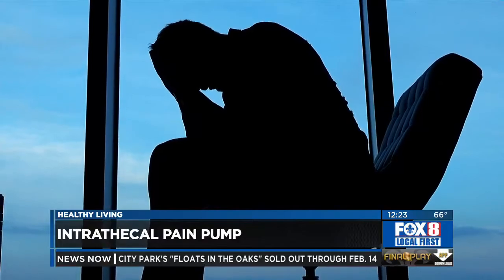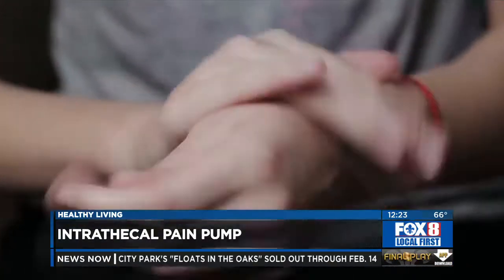So is it something you come to your office and you get it done? I mean, or do you have this pain pump at home? Explain how this works if you're a patient with chronic pain. Sure. So I always start with what people know, pacemakers, implantable devices. This is an implantable device just like any other. So we implant it right below the belt line, so it's not going to be sitting like a man's wallet, but right above it. But there's a reservoir in this pump where we can fill it with morphine, dilaudid, baclofen, bupivacaine. So it gives the patient 1/300th of the dose they take by mouth. And it's 24 hours a day. So you're no longer watching that clock, waiting for the next pill, or when that medicine wears off.